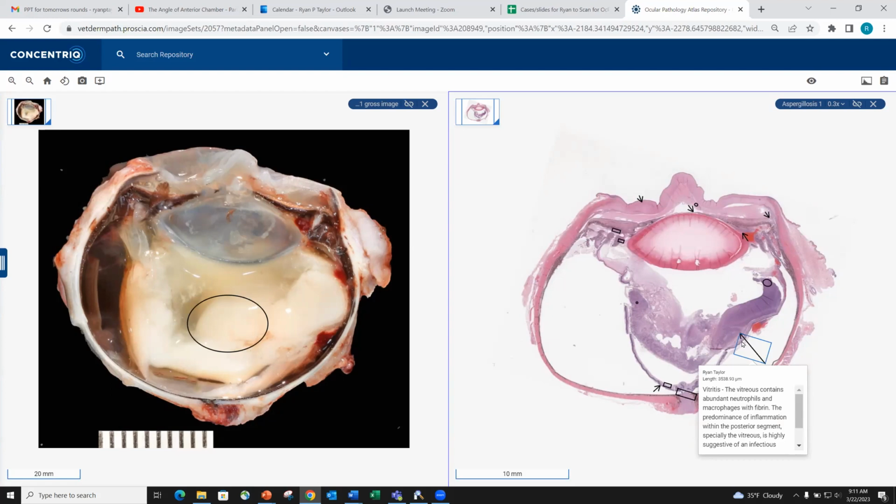Did we mark every single lesion? Probably not, because every single eye typically has intraocular hemorrhage, and I got tired of writing intraocular hemorrhage on every single slide. But we're trying to point out the salient features, the key histologic features to help you get to the diagnosis. Some of the small ancillary things like stromal vascularization in the cornea is probably going to be missed on a few slides, but most of the salient features should be present.